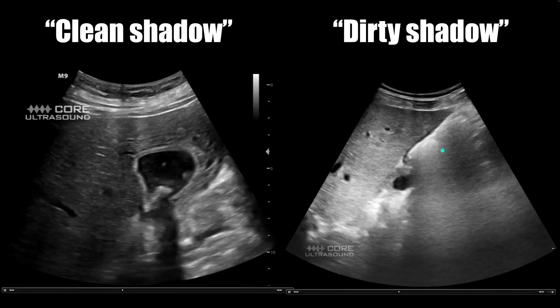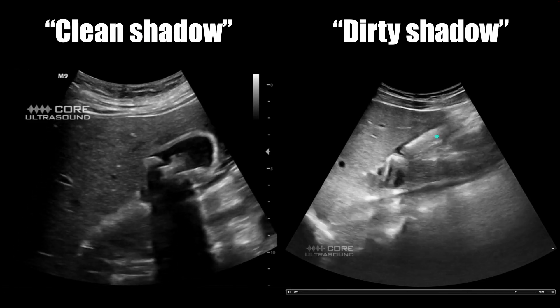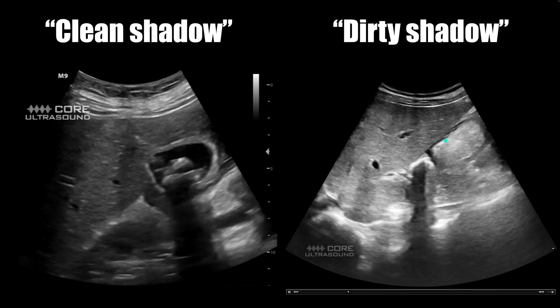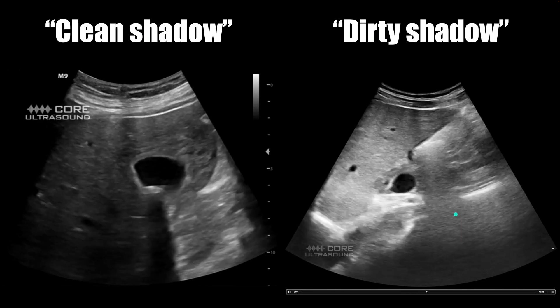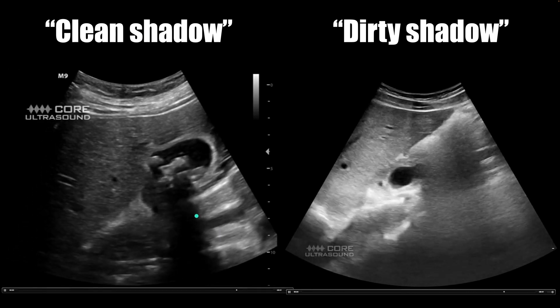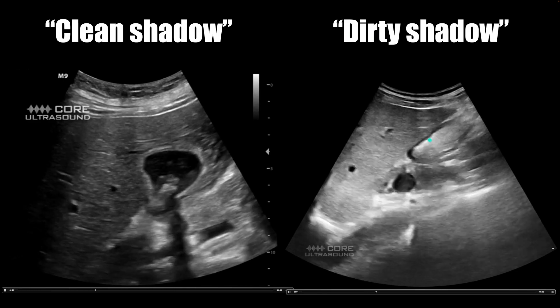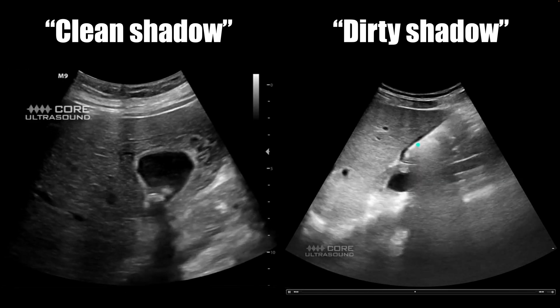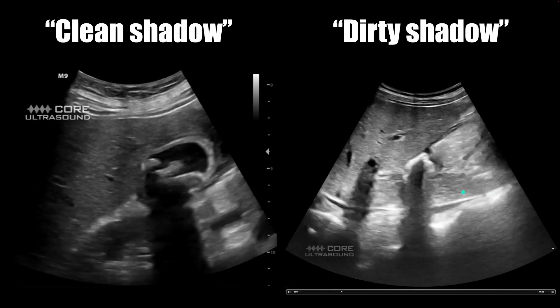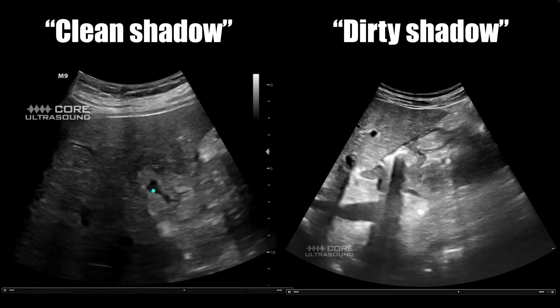Dirty shadowing occurs whenever you have something that is air-filled or has air in it. You're going to see a gray shadow deep to it. The reason it's gray instead of black is just the way that sound waves are scattered by air. Notice you still can't see deep to it, so it's still a type of shadow, but this is an air artifact.